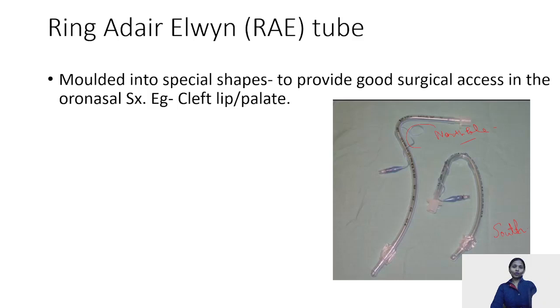The problem with these tubes is that you cannot suction through these tubes and their length cannot be manipulated because they are preformed and curved. The work of breathing and resistance is always higher in such tubes.